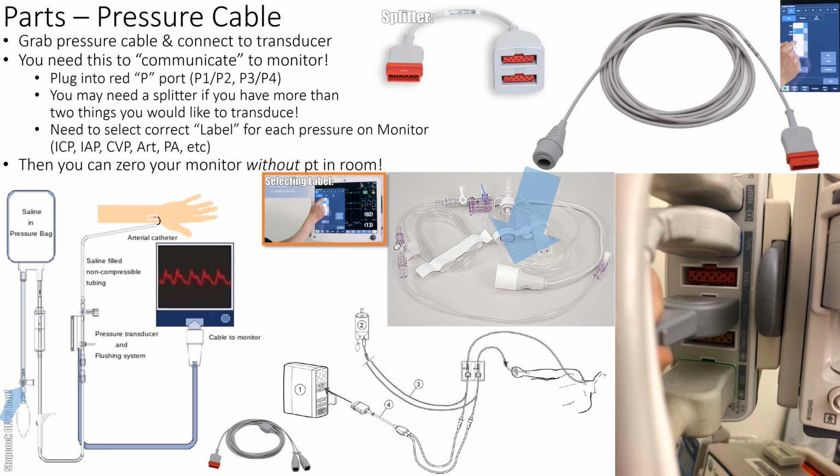All right, so the pressure cable. You have to grab a pressure cable. Otherwise, all you're doing is pushing 3 cc's an hour into the patient, right? So you plug your cable into the transducer. Your transducer has a little cable at the end there, right? Different companies have a different variety of attachment, so all of ours use the same one. And this is going to plug into the transducer at the end over here, right? So we got our transducer plugged in right there.